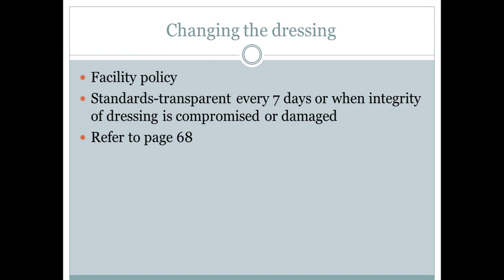If you look on page 68 of your book, there's instructions right here of how to change a peripheral IV dressing, and we'll be covering it as far as the procedures and your skills checklist as well. But obviously the most important thing is washing your hands. The book says to put on sterile gloves for that. Just see what your facility policy says, since it's not like the central line where you're using the sterile gloves and having a gown and mask on. Just make sure it's aseptic.